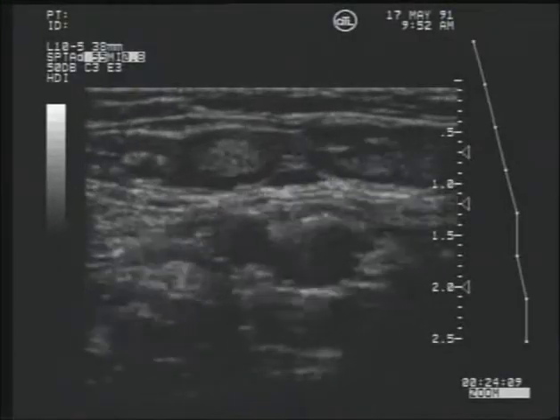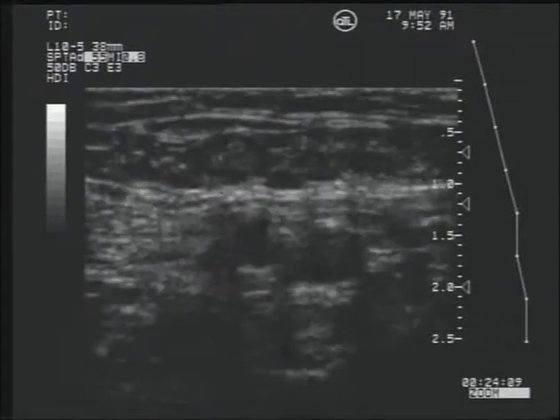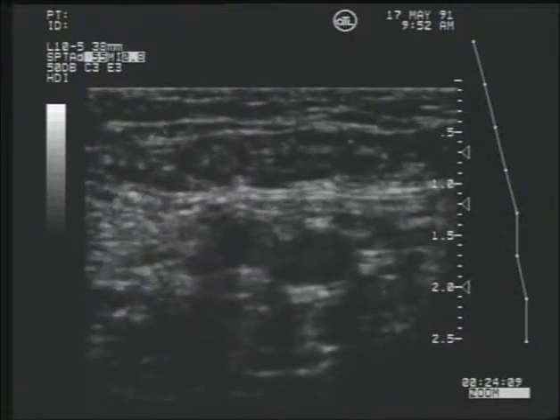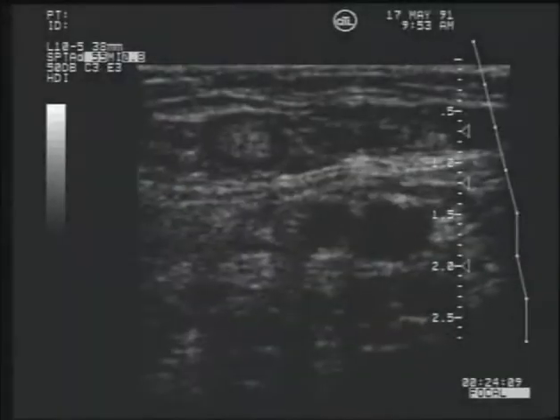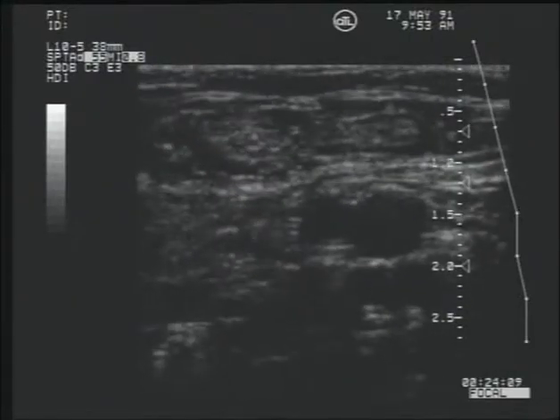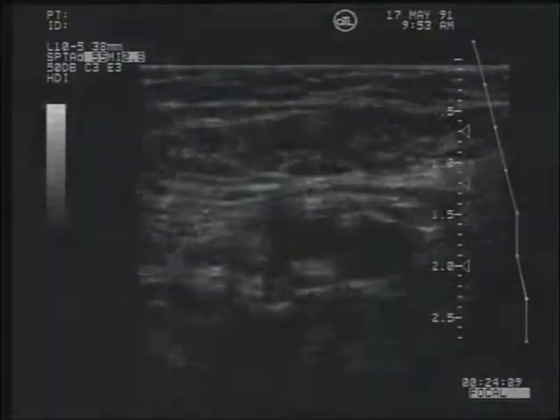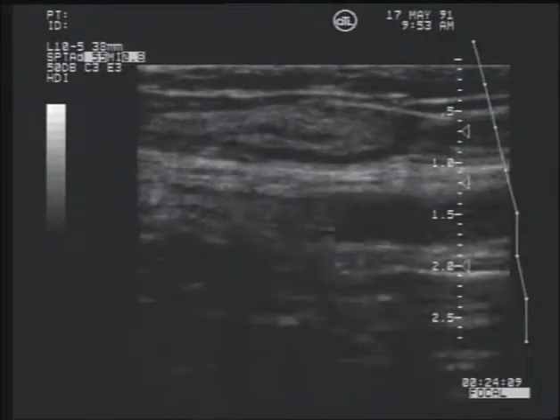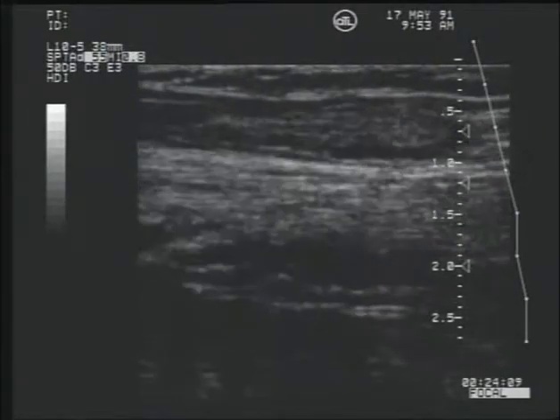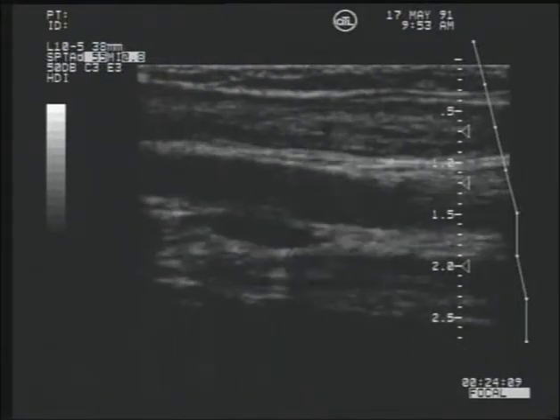Lymph nodes are numerous in the extremities and are visible on ultrasound examination. The most easily identified nodes in the lower extremity are the inguinal nodes, which lie in the groin near the femoral vessels. This can be a problem because lymph nodes are enclosed in a dense fibrous capsule that may closely resemble a thrombus-filled vein. They can be differentiated from vascular structures in that they are encapsulated, so that they cannot be followed for any distance while being imaged from a longitudinal scan plane.